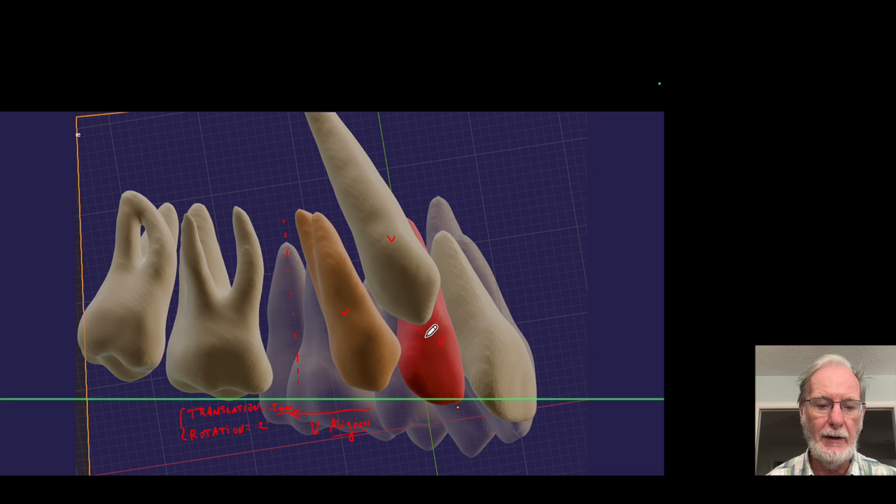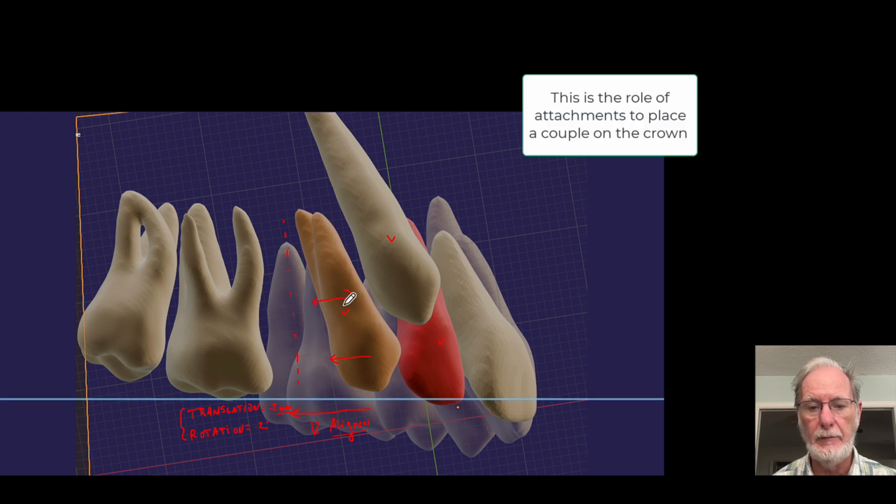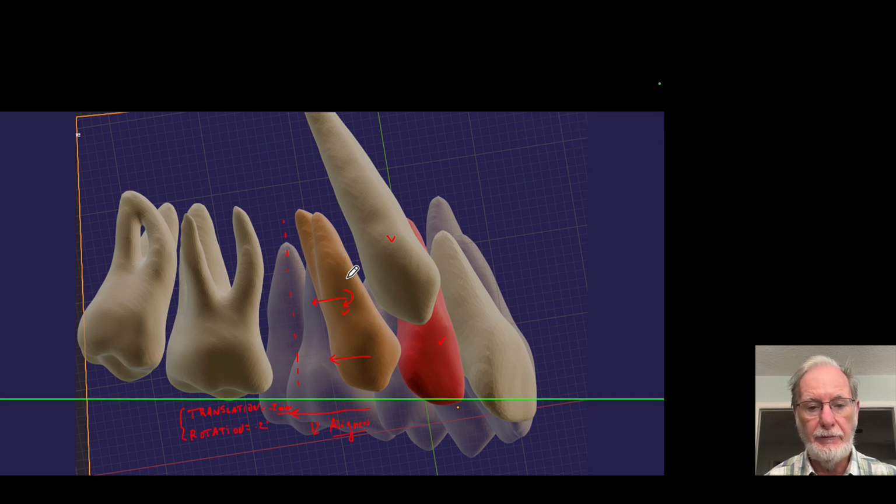The problem you have with a displacement system is that the computer usually will place a simple force on the premolar using the aligner, which will be transferred here, and will try to place a moment at the same time. And if this moment is small, probably the displacement driven will be effective.